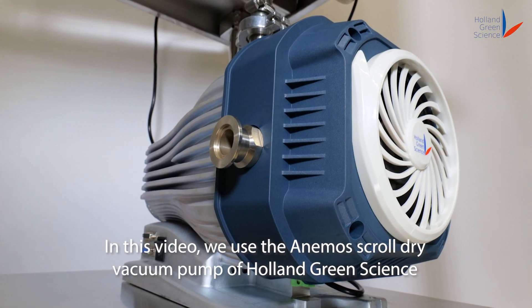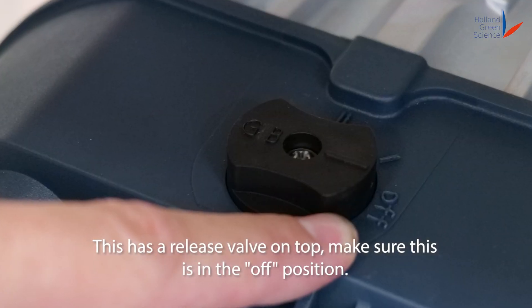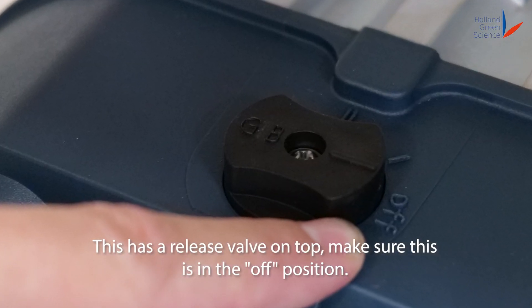In this video, we use the Anemos Scroll Dry vacuum pump of Holland Green Science. This has a release valve on top. Make sure this is in the off position.